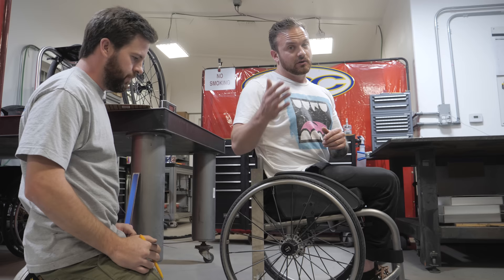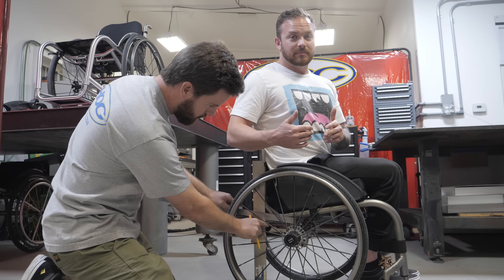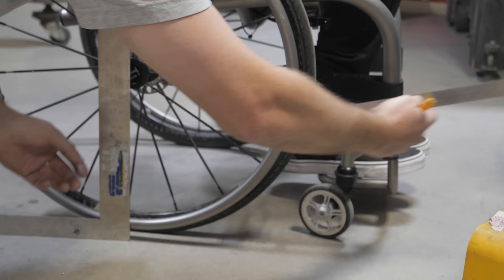If you're a newer wheelchair user, it's definitely good to have a chair that has some adjustability so you can start with a center of gravity that doesn't require as much balance, and then slowly work your way into a more tippy center of gravity.